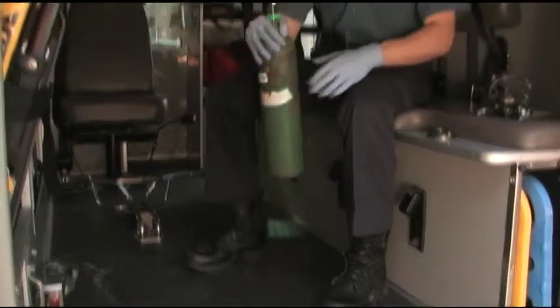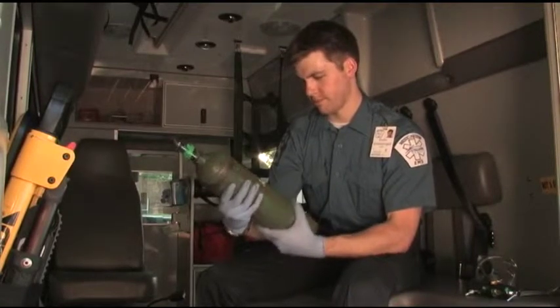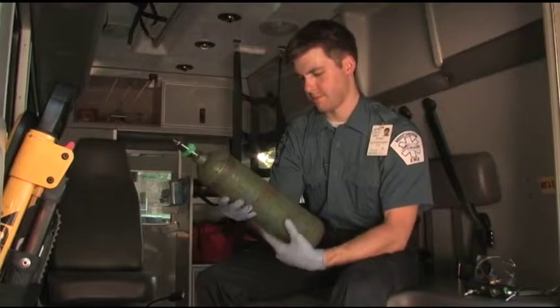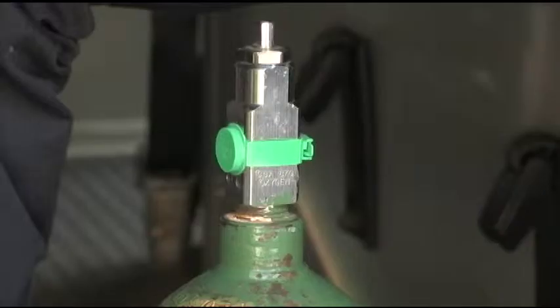Whenever working with an oxygen tank, safety should be foremost in your mind. Therefore, it is very important that you inspect the tank and regulator for damage prior to assembly. Before assembling the tank, be sure that it contains medical-grade oxygen. Medical oxygen tanks are usually green or stainless steel with a green stripe at the top and are labeled Oxygen USP. In most cases, you will find a seal or plastic wrapper around a full tank.